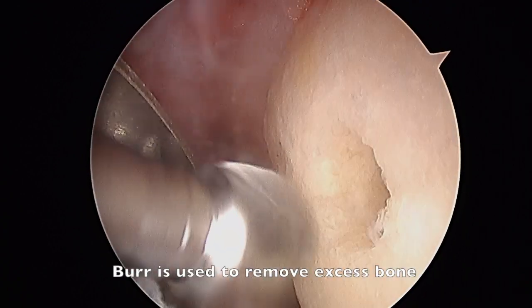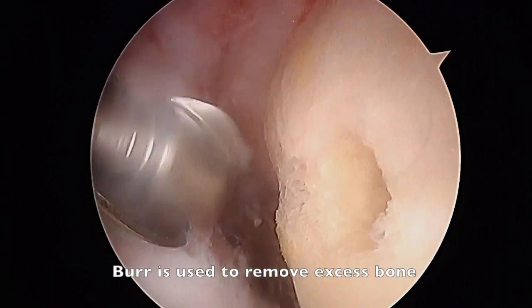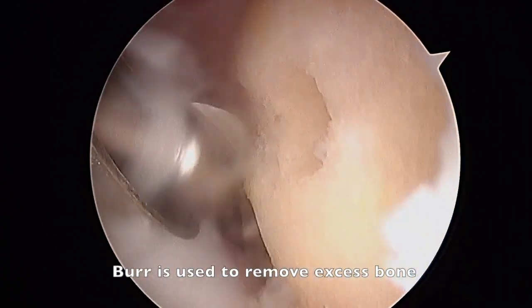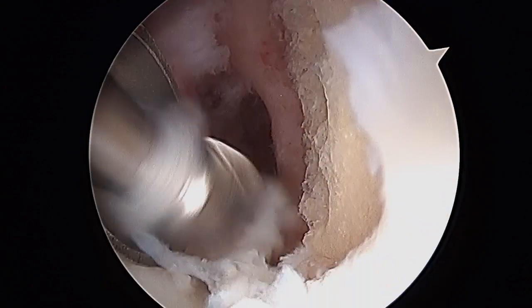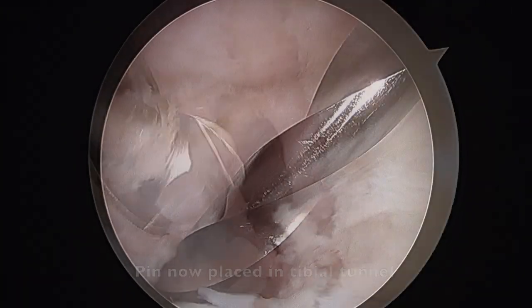Excess bone is then removed and smoothed to ensure smooth, easy motion of the knee during the recovery period.